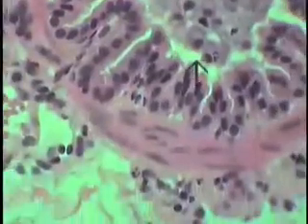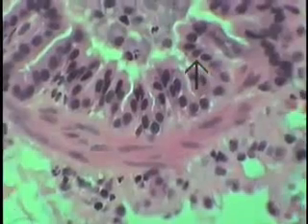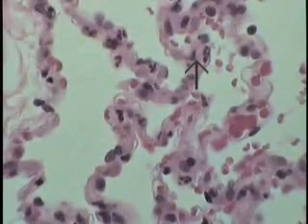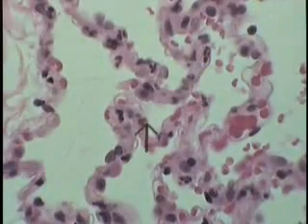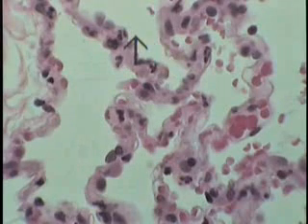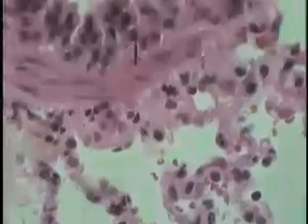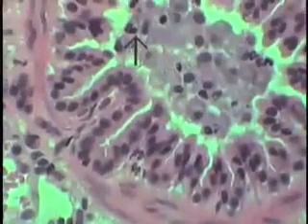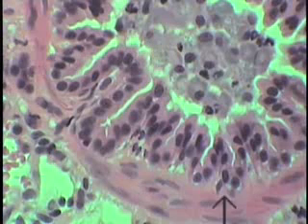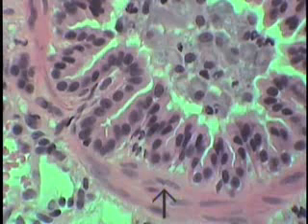To give you an appreciation for the differences in size. Another alveolus showing portion of its lumen shown here, another is shown here, another here as well. So this is a portion of the wall of a typical bronchiole as seen at high magnification.